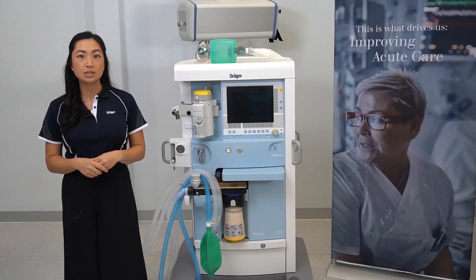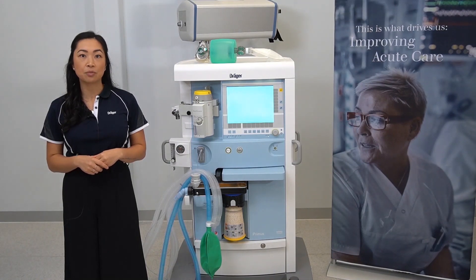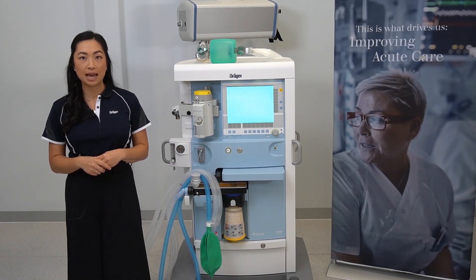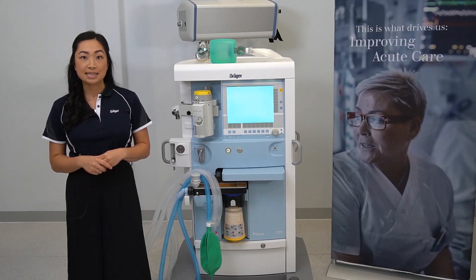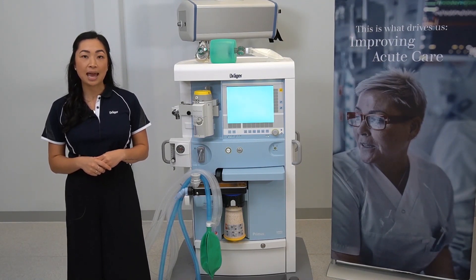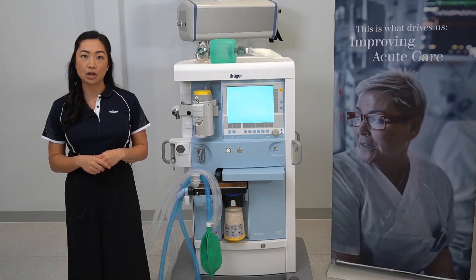A system test will need to be performed every 24 hours or every time the device is switched on. You will not be able to access the system test from the main screen — you will need to turn the device off. During the system test, the flow sensors will also be calibrated. The system test runs for approximately five minutes but can be cancelled in case of an emergency; just keep in mind you will need to perform a test at the next earliest convenience.